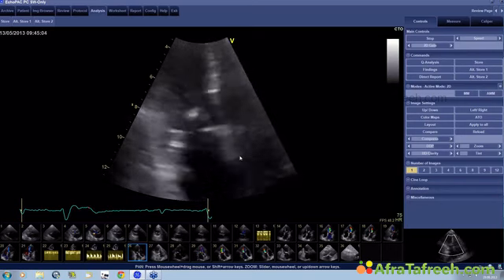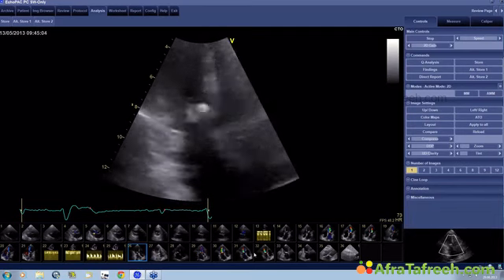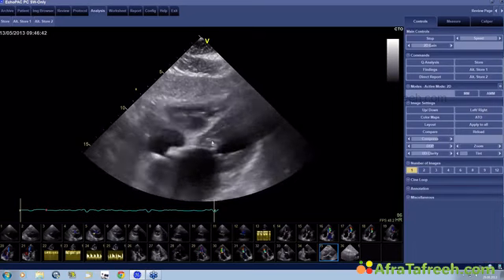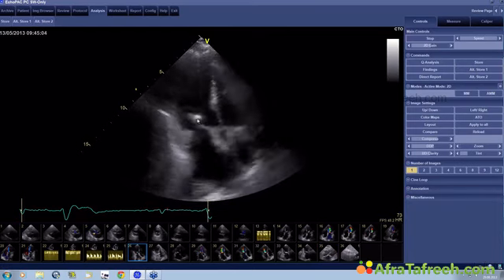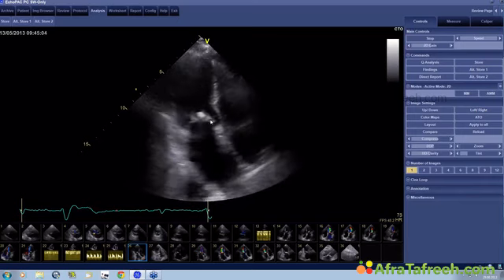One factor is thickening of the mitral valve. Now, this is certainly a very thick mitral valve. I can show you a few other images. You see how thick the valve here is. The whole anterior leaflet measures several millimeters. So there's a grading scale from 1 to 4. In this case, I would give the patient probably at least 3 for this.